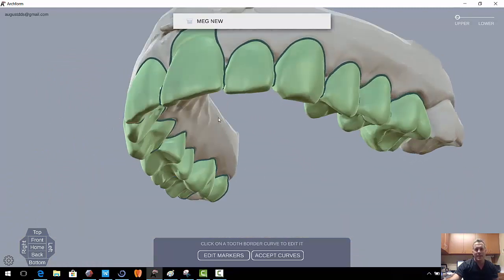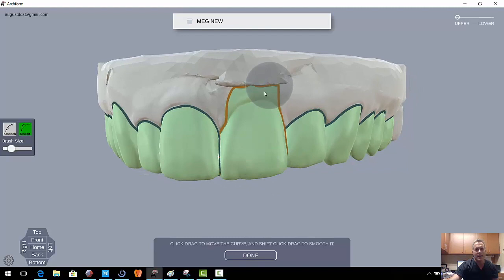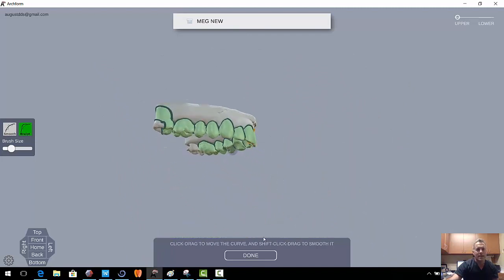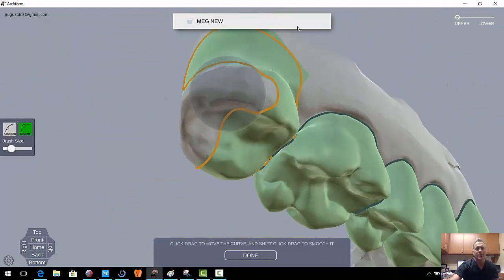So we just click on the upper, and I'm going to come over to here and click on a tooth. And now I can work on pulling down these lines, and sometimes there's a lot to pull down. And then I can go into Smooth and smooth these lines and go back to Sculpt. And move those around. We can now look at the lingual, and it did a nice job over there. This one's looking a little wacky, so I'm going to click Done and double click over here. And looks like I got a lot of work to do.